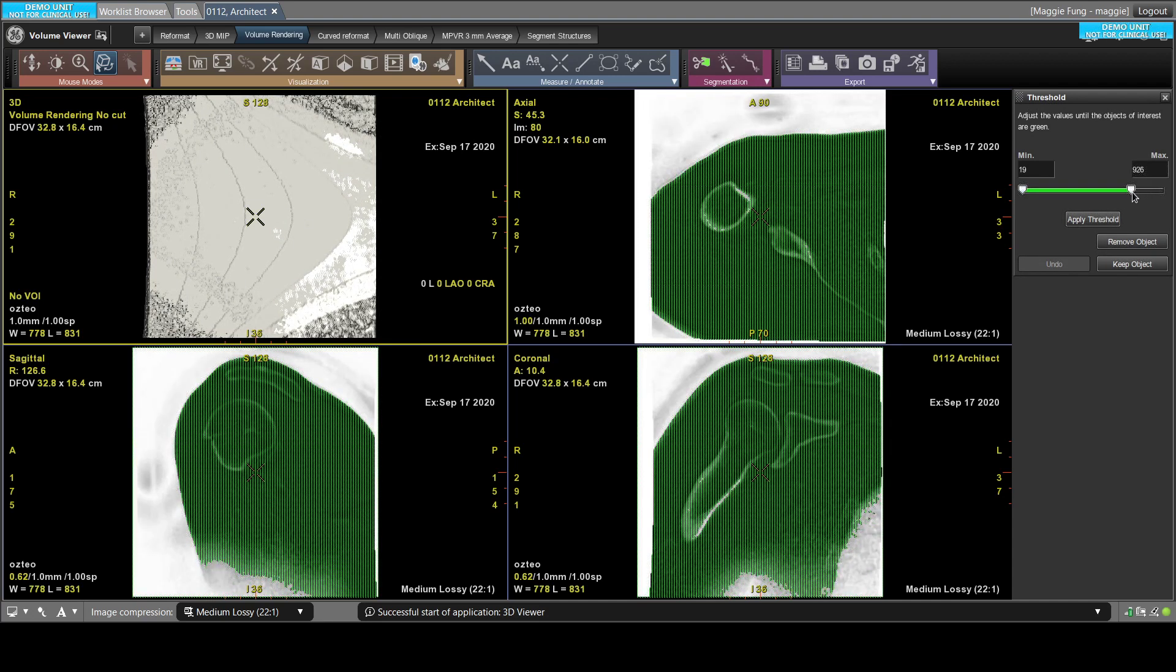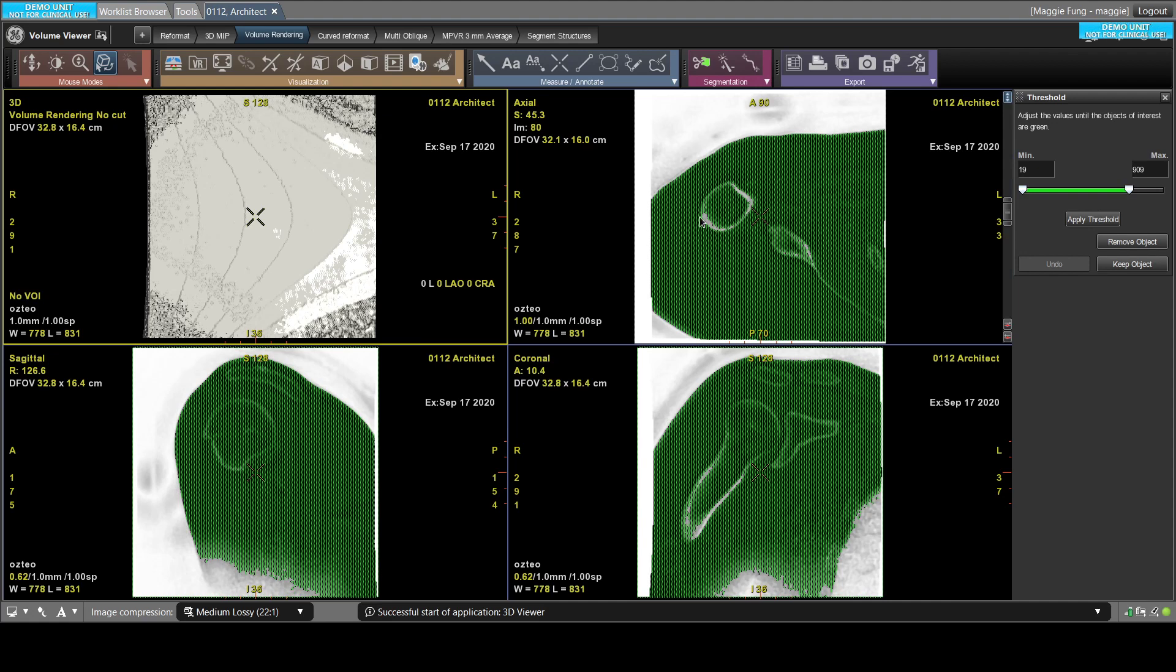So you can see that the air is being removed. You can be a little bit aggressive on it, even though it removes some of the bone. It's okay, we can fill that back in later. So do apply threshold.